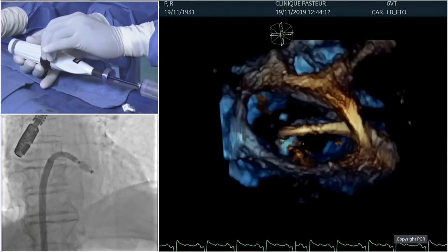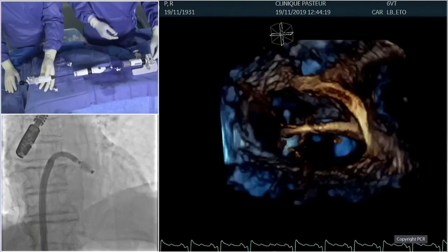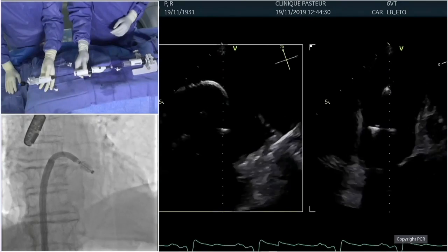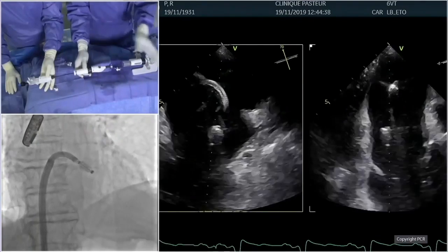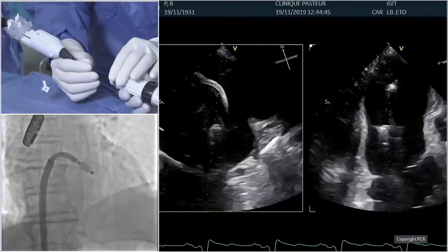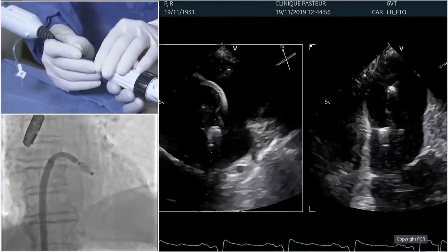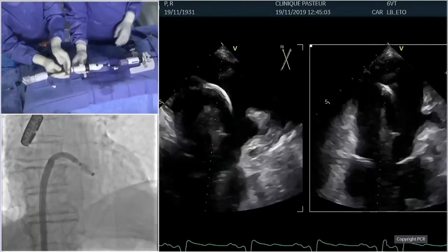Okay. And maybe before, in order to help us refine our trajectory, Didier, we can come back to and explain a multiplane view that will help us to look at our trajectory both in the bicommissural view that you will have on one side of the image, and in the LVOT view that you will have on the other side. So it's true that the steerable offers various options in terms of really mapping the overall surface of the mitral valve. So now you have the echo image on your screen. On the left side, an equivalent of the bicommissural view. On the right, almost an LVOT view, but not exactly a perfect one. So Nicolas, just stop here for a second. Maybe explain those two images, what they show, where you are: lateral, medial, posterior, anterior.